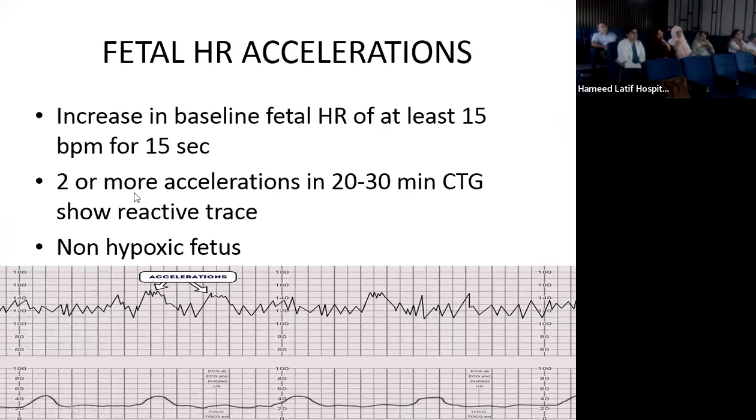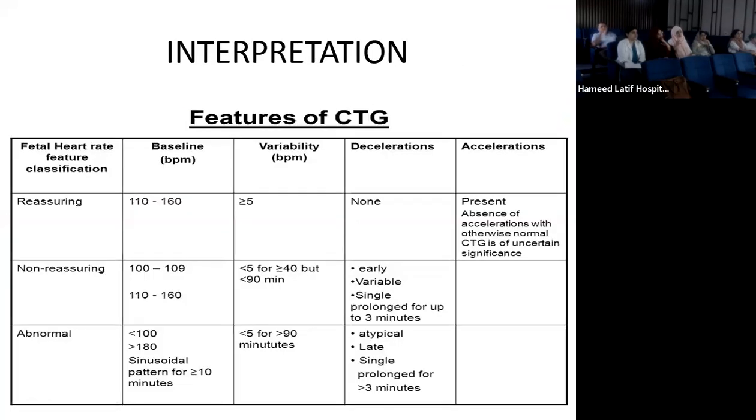All right. You also mentioned there's this last pattern called sinusoidal. Yes, sir. Okay. So sinusoidal reflects what? What sort of pattern is sinusoidal?